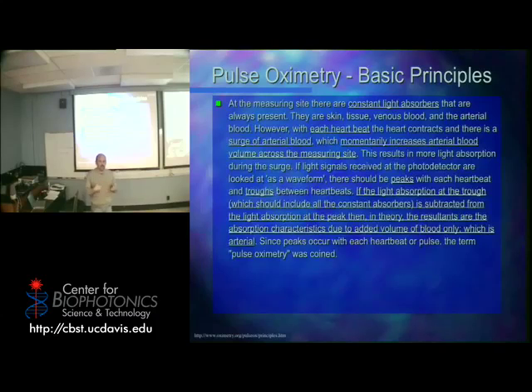Okay? They might have done some of this in the operating room too, because they had an easier time getting access to the blood, depending on certain procedures. But they had to figure this out because eventually they now end up using this in every single surgical procedure that's going on. They've got to monitor for the oxygenation.